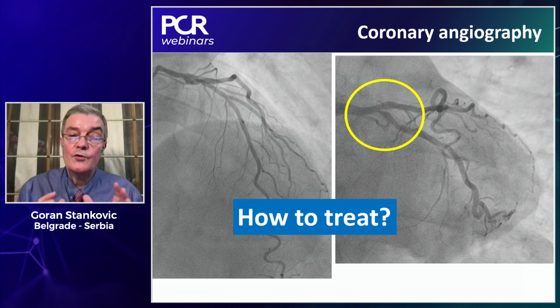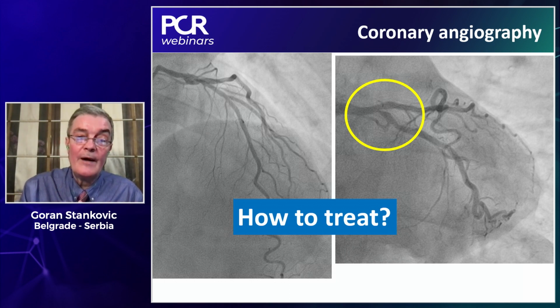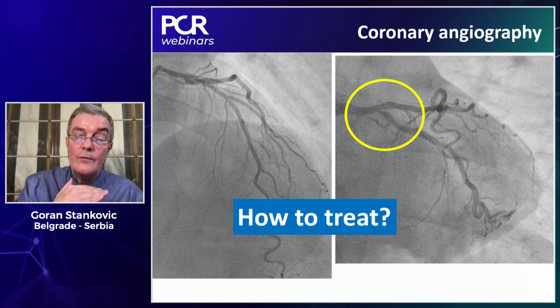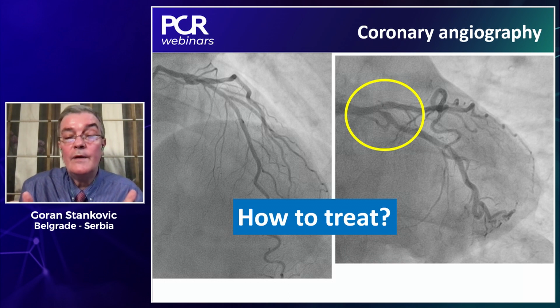Yeah, I would agree 100% with all that you just said. And I would like to introduce, for people who attend this webinar, that when we speak about provisional, we actually speak about a stepwise layered strategy. So when we say provisional, we don't decide from the beginning if it's one stent or two stents. We put one stent towards the diseased side branch, in this case the circumflex, we optimize the result inside the left main, and then we evaluate after POT whether it is acceptable or there is compromise. If we need to do more, we do kissing, LAD and circumflex.